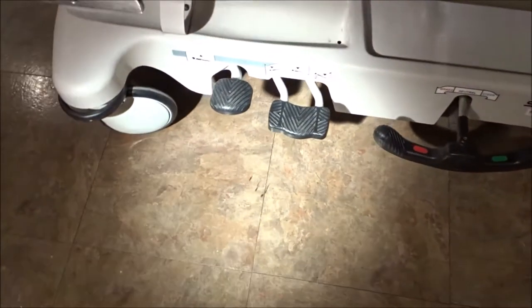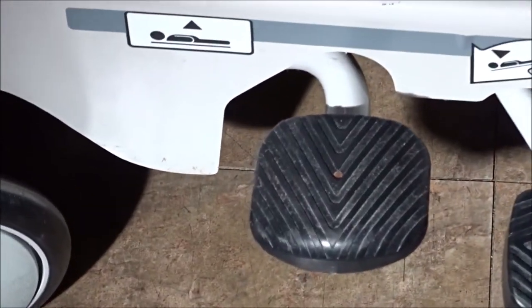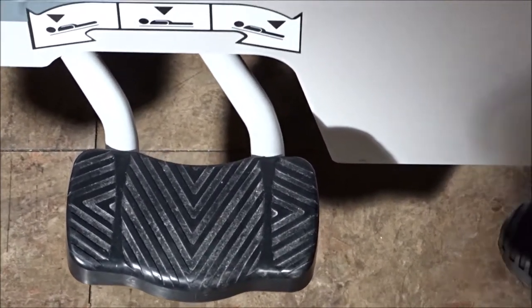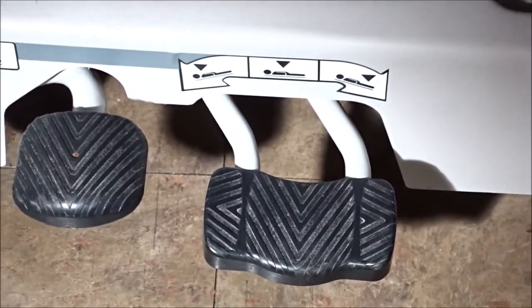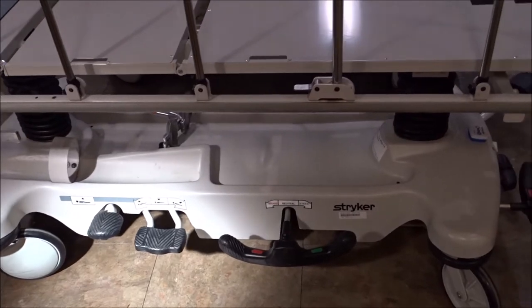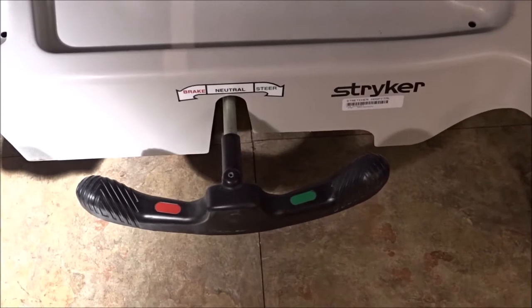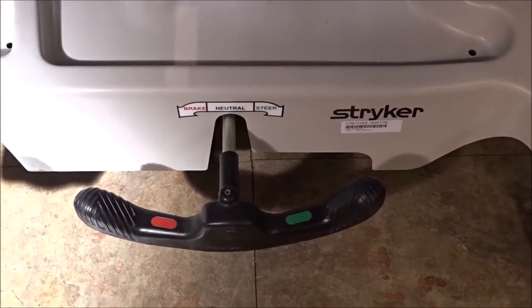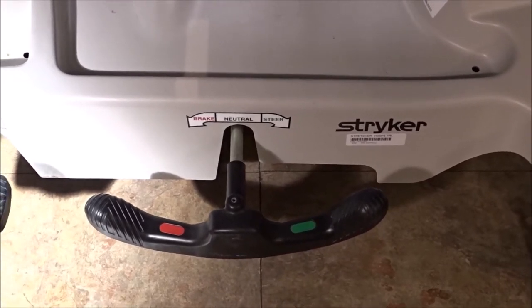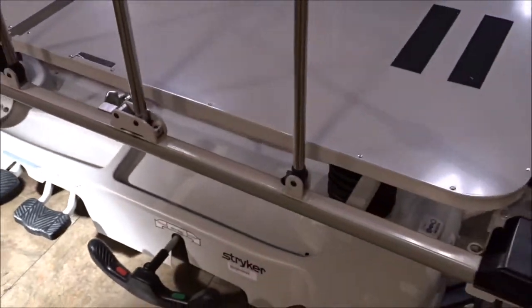Just like all the Stryker stretchers, you're going to have the kick pedal right here, which raises and lowers the stretcher. When you push it straight down in the middle, it's going to bring it straight down, and you can do Trendelenburg and reverse Trendelenburg. You're also always going to have your kick brake — when you kick it down on the left it's going to lock it; if you kick it all the way down on the right it's going to lock it into a steer mechanism and basically keep it going straight down a hall. In the neutral position, the stretcher can be moved in any direction.